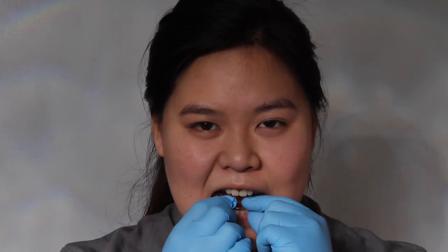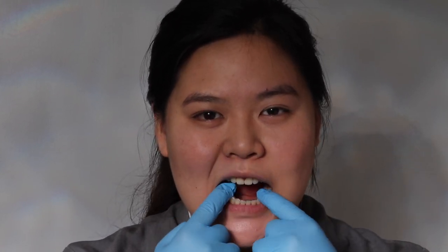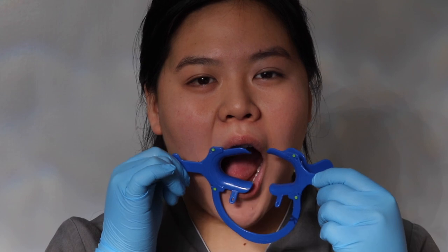The first scan involves putting on your aligners. If you're not sure how, please refer to our how-to insert and remove aligner videos for more details. After putting your aligners on, retract your lips with the lip retractor.